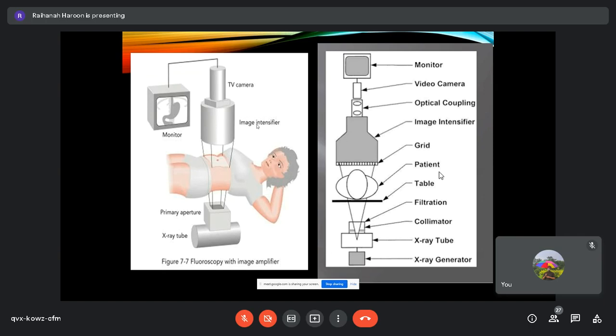She can do that if there is a fluoroscopy machine. Maybe she has seen a fluoroscopy machine in an OT before and she thought it's the same machine, but it's actually not. And she exposed a patient to a full-dose chest radiograph 17 times. You just imagine. I've never seen anyone having such frequent chest X-rays in a day, except for what happened at that time. So it became an issue for the department.